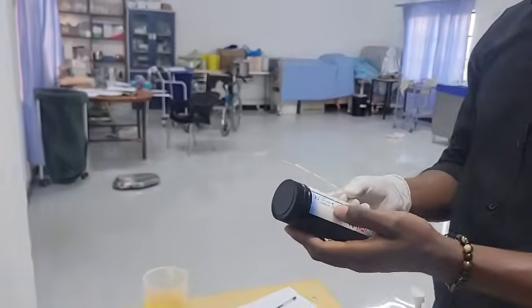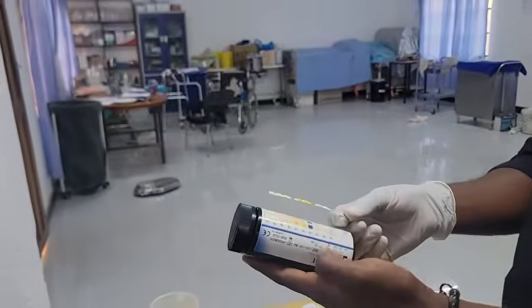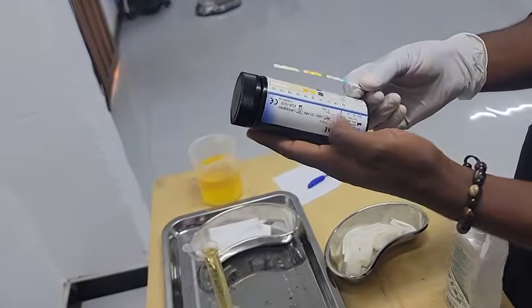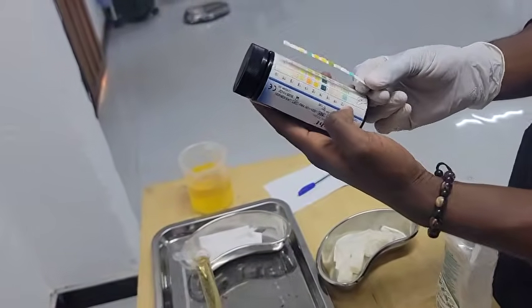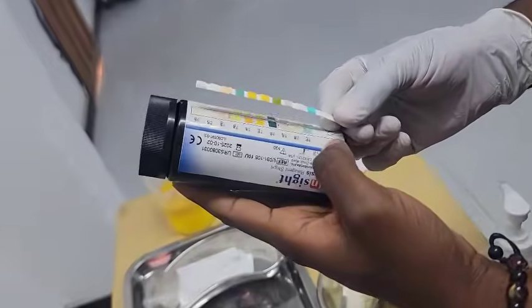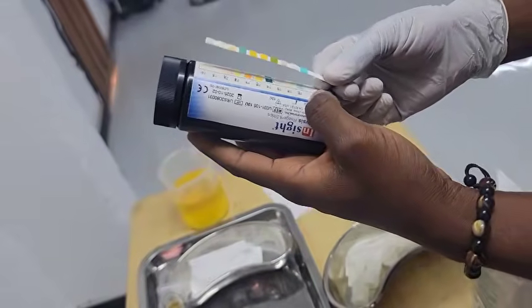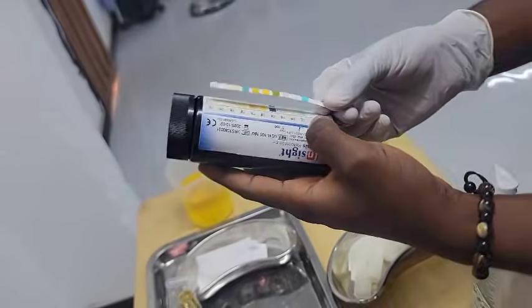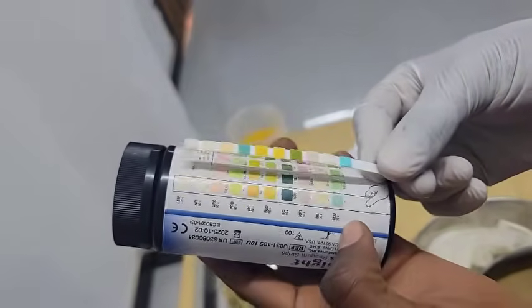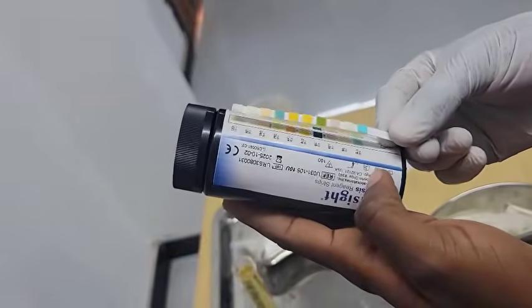You need to start comparing from what is on the bottle and the colors that are changing there. So you are going to start reading from the bottommost. So the bottommost there is glucose. So you start with glucose at 30 seconds. So after 30 seconds, you start reading to the examiner. So you say glucose at 30 seconds, you compare the colors. So glucose at 30 seconds is negative.